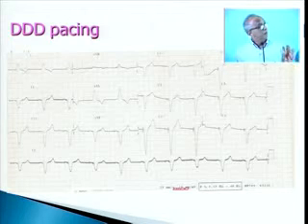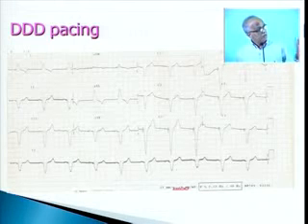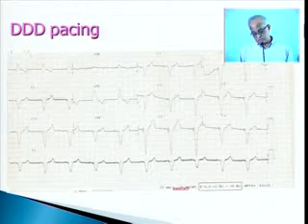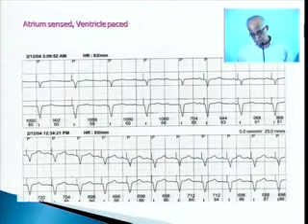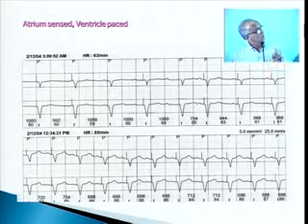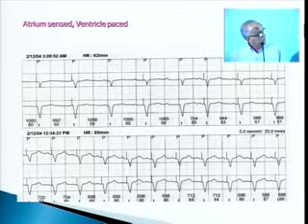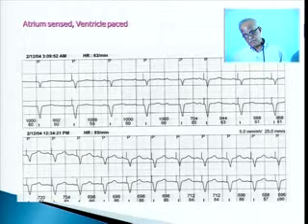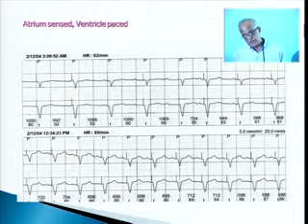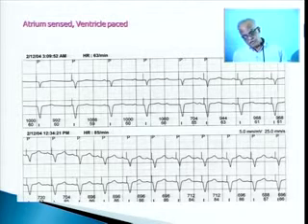They don't get into pacemaker problems, and they can exercise. If you can increase the heart rate as needed, then they have good exercise tolerance. They can go swimming, play games, all these things they can do. Next, these days we have a single lead that can do atrial sensing. The lead is floating in the right atrium, and it senses and paces the ventricle. So you have the benefit of atrial response to exercise. Whenever you want to increase exercise, depending on the oxygen saturation or the breathing, this increases the heart rate. So you have the atrioventricular synchrony.